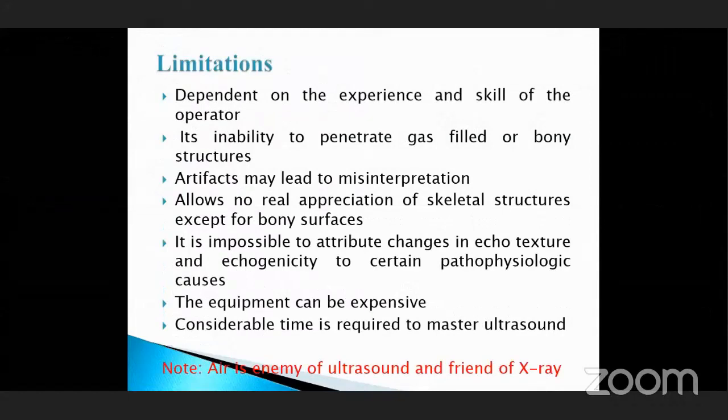Now, limitations. Ultrasonography is highly dependent on the experience and skill of the operator. Its inability to penetrate gas-filled or bony structures means any structure beneath the gas-filled structure or beyond the bony structure cannot be seen, so abnormality of that area cannot be diagnosed. Artifacts may lead to misinterpretation.